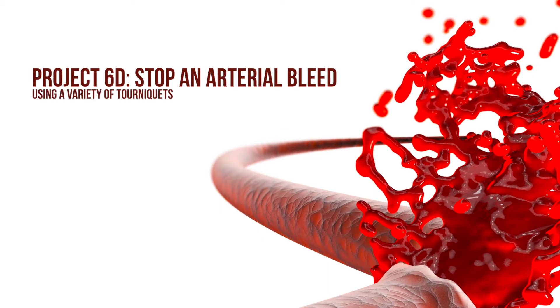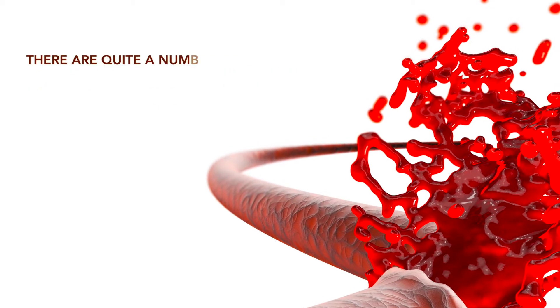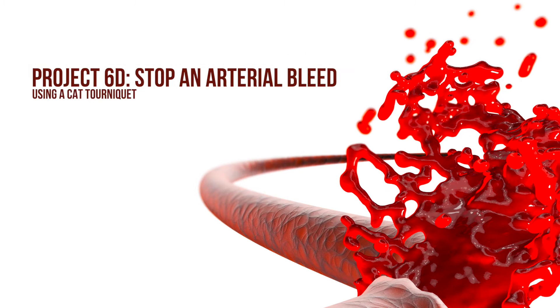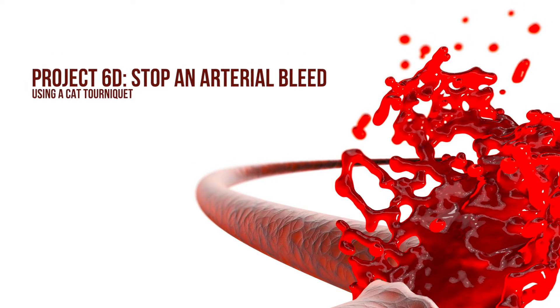Project 60: stop an arterial bleed using a variety of tourniquets. There are quite a number of tourniquets available on the market, and if required, one can create an improvised tourniquet. Project 61: stop an arterial bleed using a CAT tourniquet.